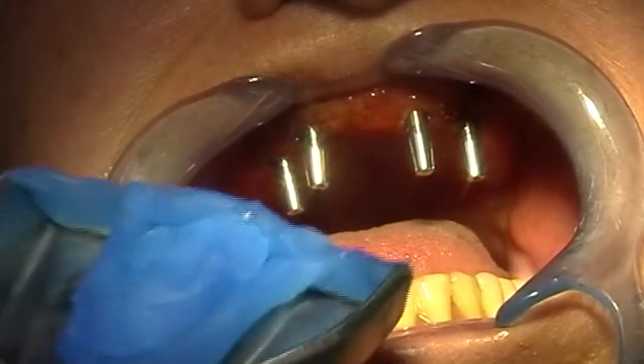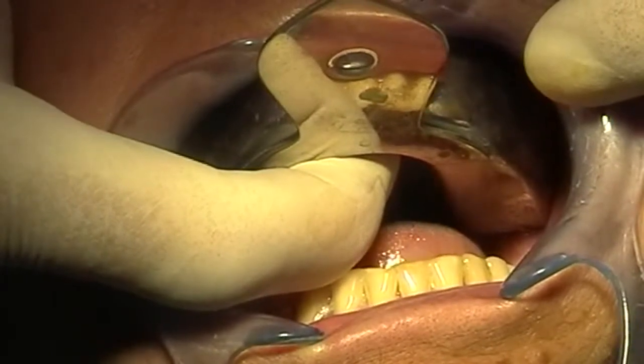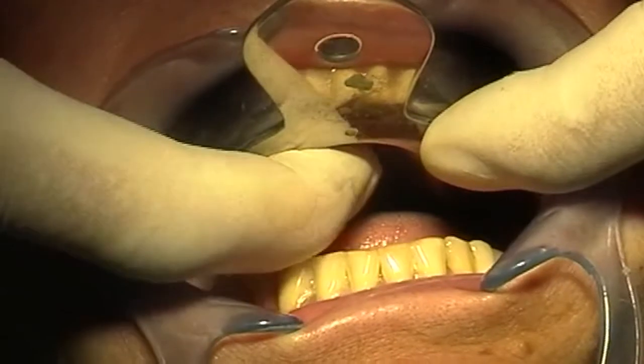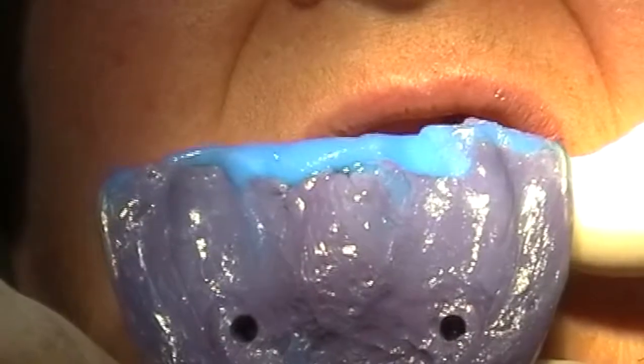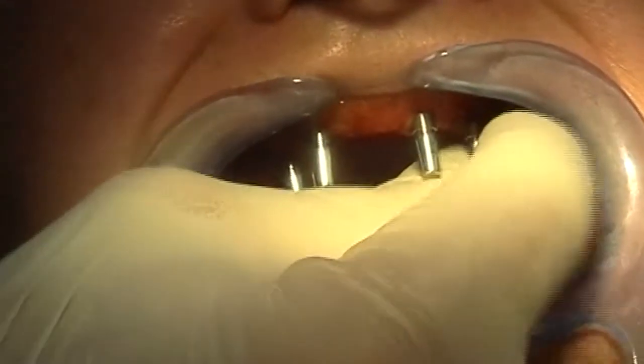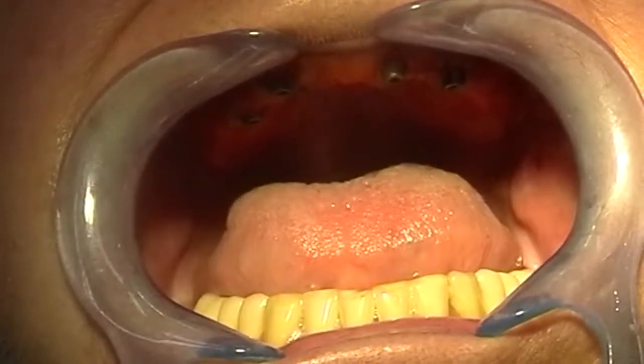To take the impression we use a normal closed tray impression tray. I recommend using a polyether material for this impression — I normally use Impregum. Once the impression has been taken we have to unscrew the transfers and protect the abutments with these caps.